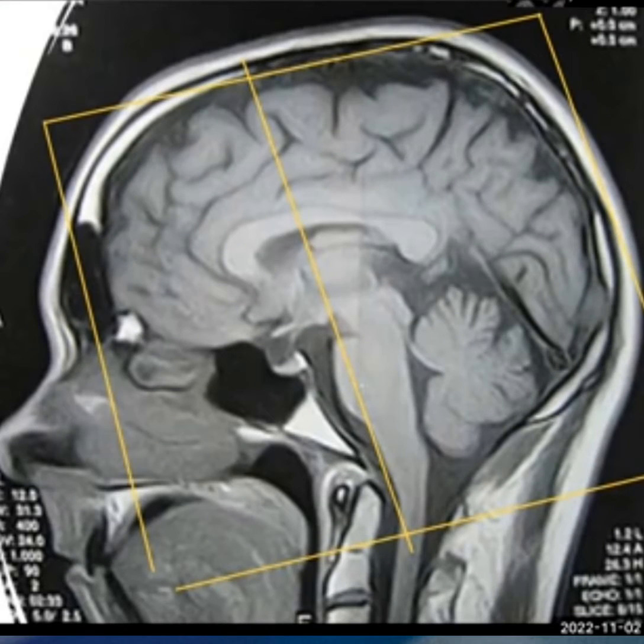Here I'm taking the sagittal image, and we can clearly see the brainstem. So the slice coverage will be from the frontal sinus to the occipital protuberance. The occipital protuberance is that bump on the back of our head.